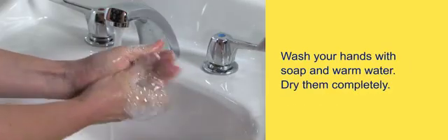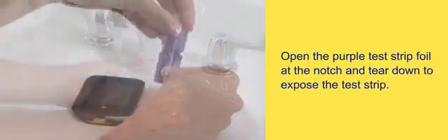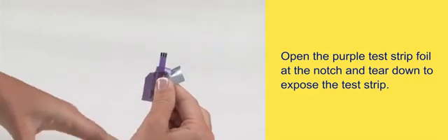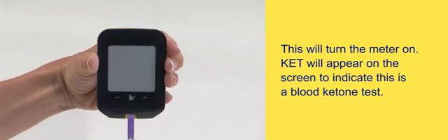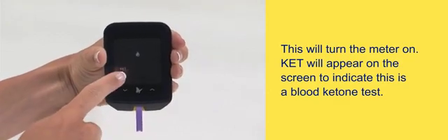Wash your hands with soap and warm water and dry them completely. Open the purple test strip foil at the notch and tear down to expose the test strip. Insert the purple test strip into the meter until it stops. This will turn the meter on. KET will appear on the screen to indicate this is a blood ketone test.